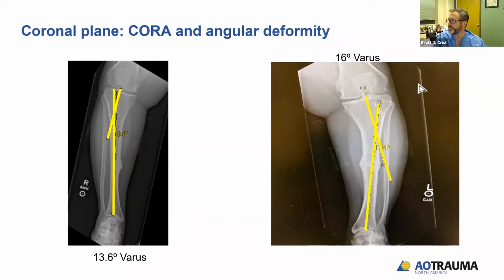Mitch or Tim? I would try to see if I can do it with an IM nail, even though I don't know if it's truly pathologic bone at her age. She's made it thus far without breaking things. I don't know if you need to put an IM nail to, quote, protect the whole bone like you would with other metabolic bone diseases, but I would try to do this with an IM nail.